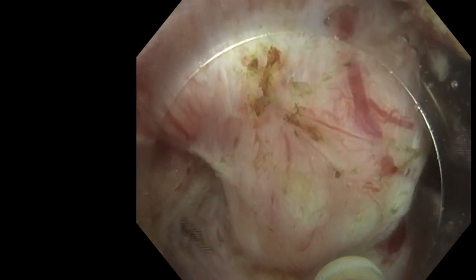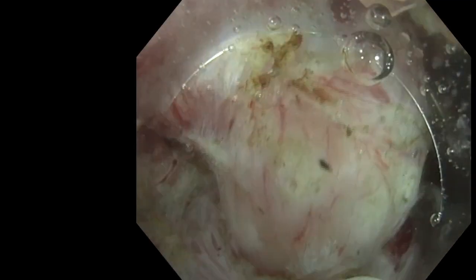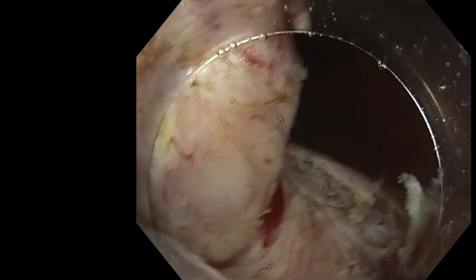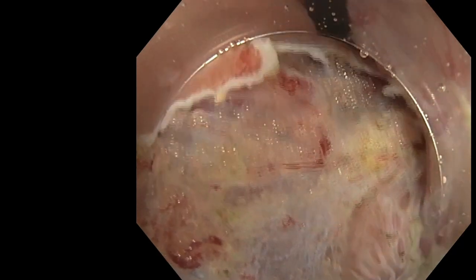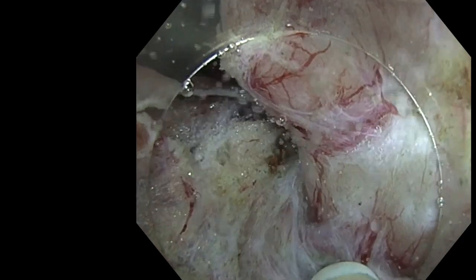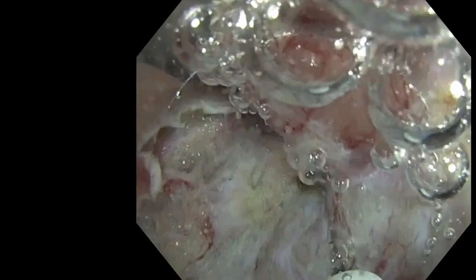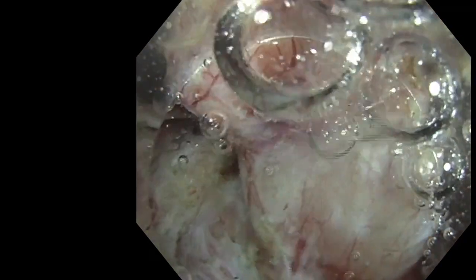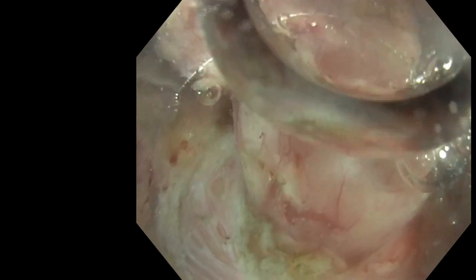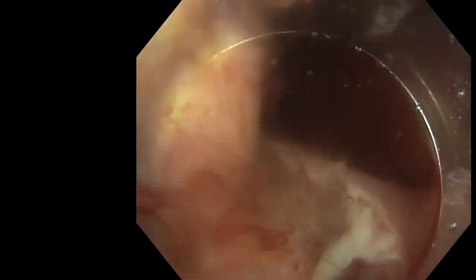And progressively, the force of traction is only on the center, and therefore it opens the diverticula and it turns the diverticula itself, so it makes the exposure easier thanks to this traction. And once again, we should turn around to remove all the fixation points that are remaining all around the diverticula, because if you still have some points, it prevents the traction to get all the diverticula outside his hole.